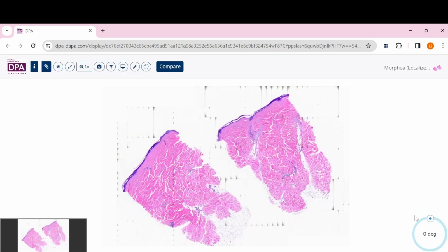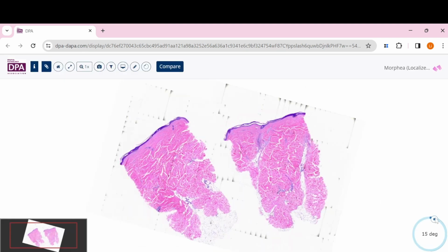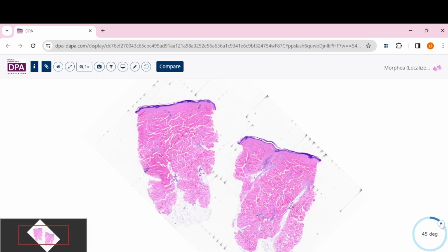Then I don't think this is a really great mimicker, but still in the book, that is Morphea. Morphea is localized scleroderma. If you want to make the diagnosis of Morphea at low power, you can see this deep punch biopsy. Usually with a punch biopsy, you cannot see this rigid edge. We call this a square punch. That means the whole punch is just like a square. Usually you won't see a square punch.